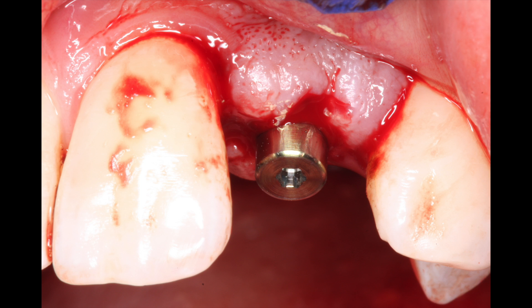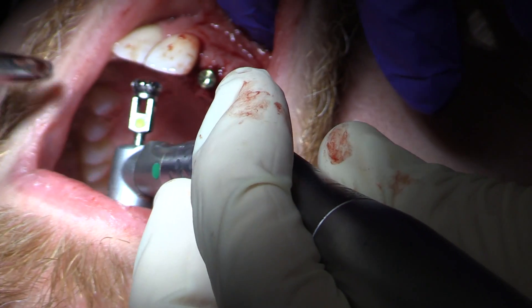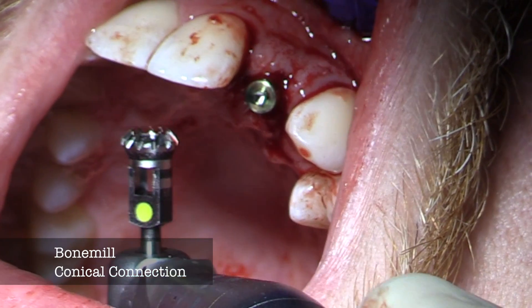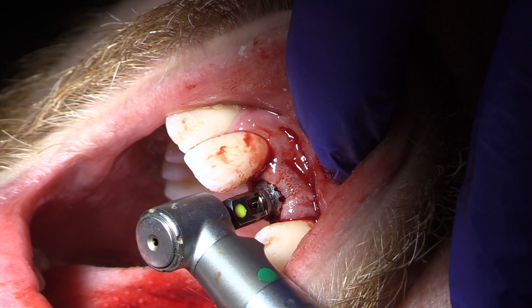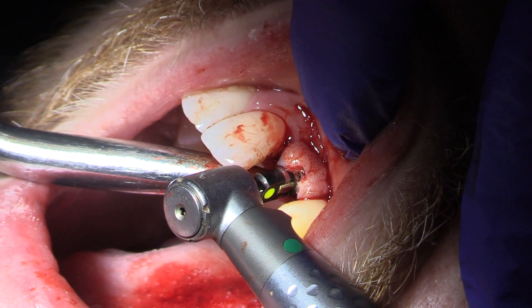It's important to check and make sure that once you place this abutment on, the bone mill is not going to hit the adjacent teeth when you put it down inside — you wouldn't want to groove out the sides of those teeth. This is a 5.2 so we shouldn't have any issue here since we're replacing a lateral. You can see the bevel of the bone mill which cuts to an emergence profile that's going to match the abutment — it will be 0.2 wider than the abutment we place. As we put it in we're looking to make sure it's not going to hit adjacent teeth, then we start it and it just cuts a little bit of bone around the top of the implant in a very precise way.